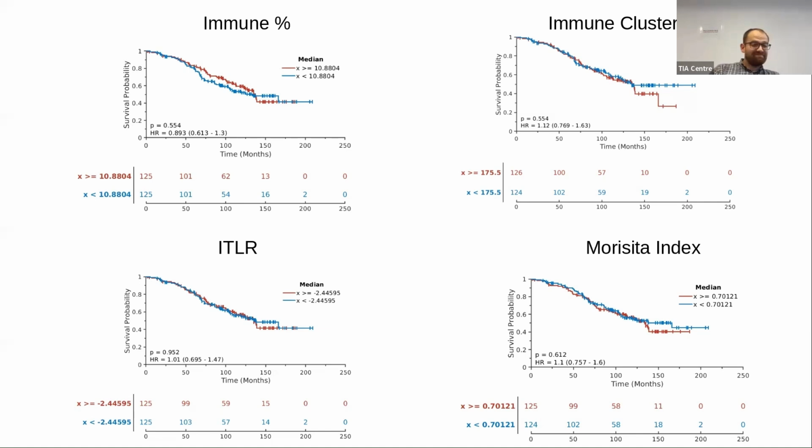So if you were blinded to the outcome, how did you compute these results at the beginning? Well, we were blinded to the outcome data, so we didn't know time to metastasis or time to recurrence, but we had access to the histopathology slide, so we could detect cells and do Gleason grading. But to do this, you need the outcome data, right? This would have to be unblinded. So this was when we unblinded. I did these Kaplan-Meier curves. You send the features and they will compute these Kaplan-Meier curves. Yes. Basically we had a clinical PhD student who collected all the data, and so we sent the features out to her, and that was how we got these metrics. So she would compute these, but she wouldn't share the clinical outcome data with you.